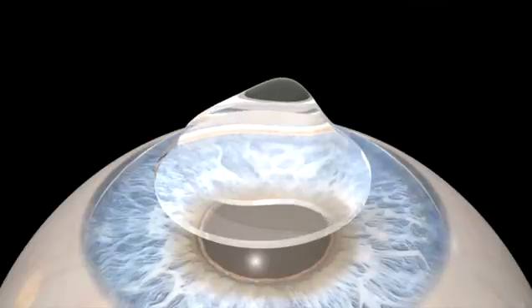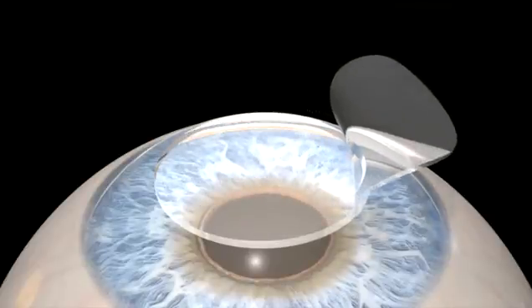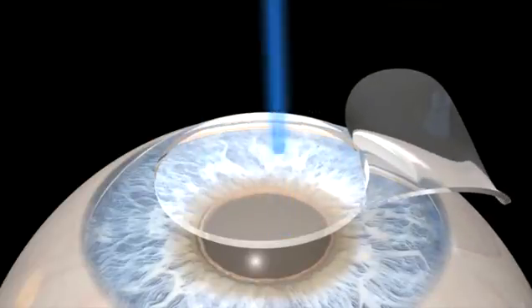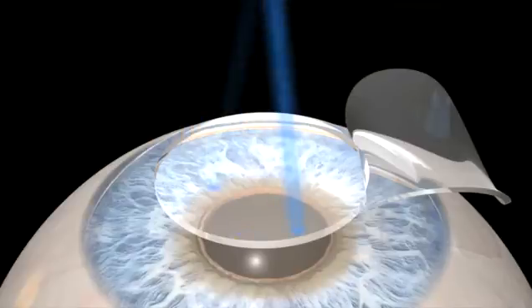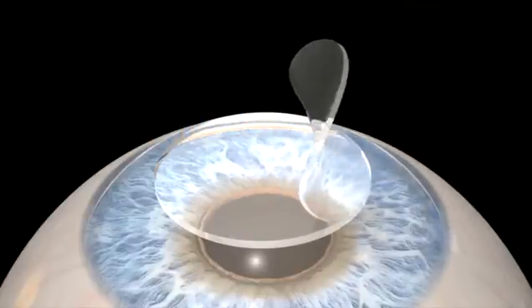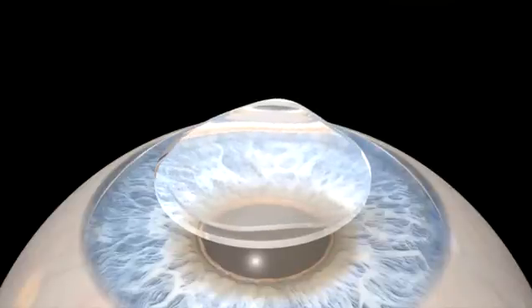The corneal flap is then folded back. Using measurements from your eye's corneal curvature and biomechanics, the laser removes the corneal tissue necessary to correct your vision while creating a more natural, aspheric shape.